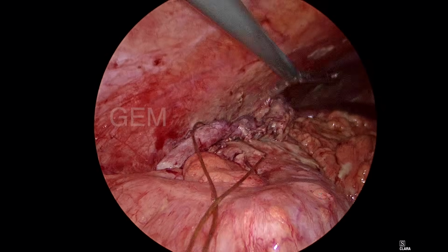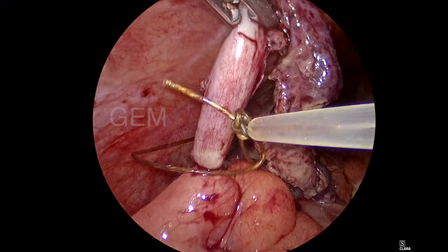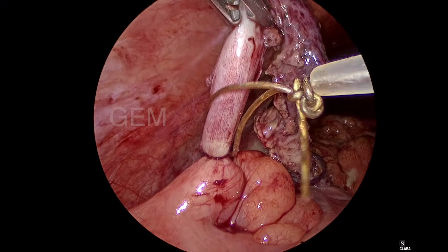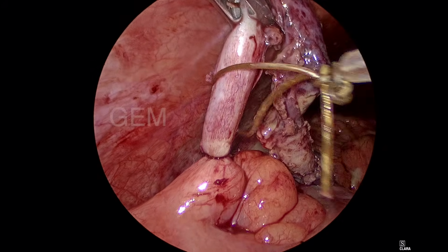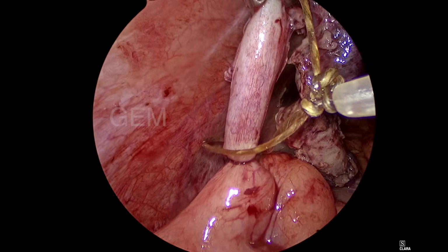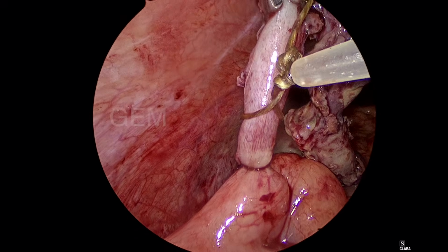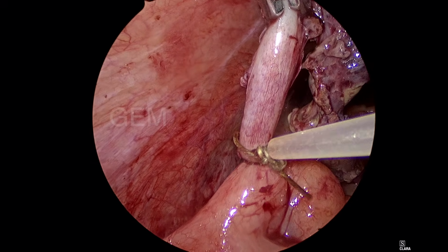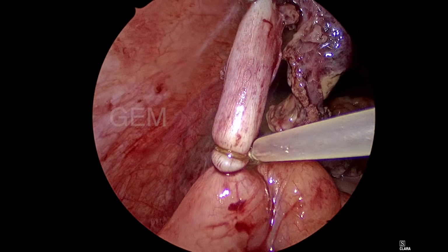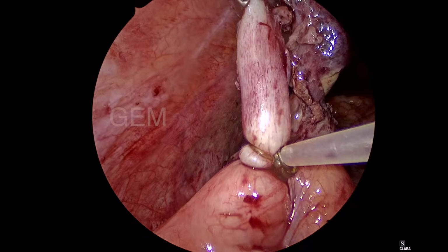Many surgeons do it with only one loop, and some surgeons apply a clip to the base of the appendix. There are a lot of articles, and I could see one or two articles from Bangladesh. They apply a Hem-o-lok clip to the base and then divide. But our practice is always two endo loops with catgut, at a 2 to 3 mm distance. This loop you can tighten very well.